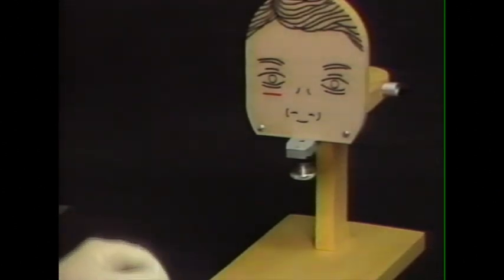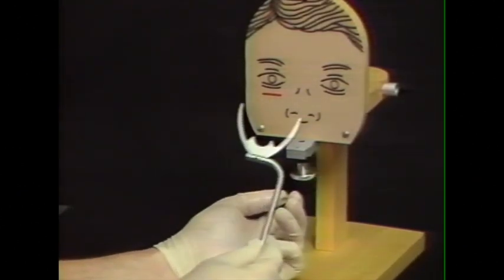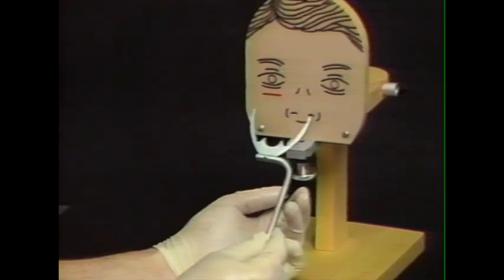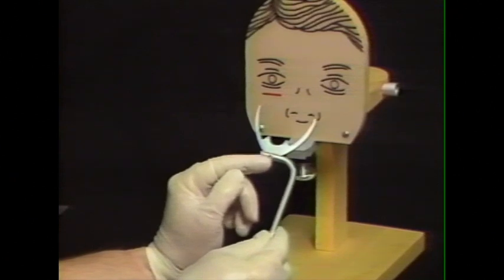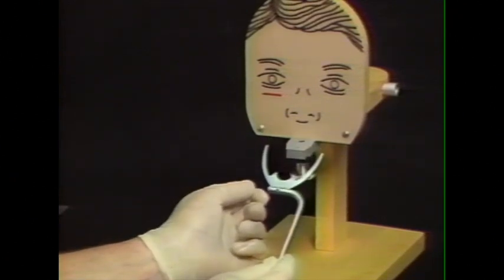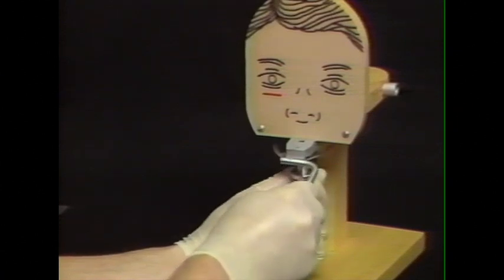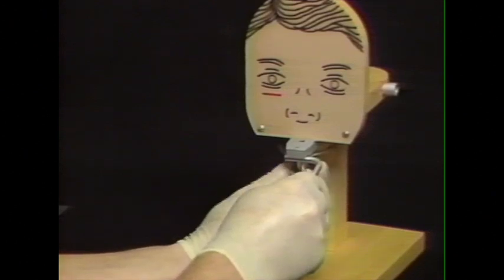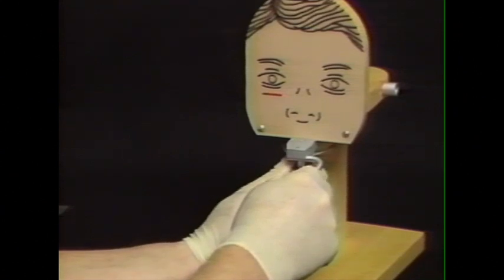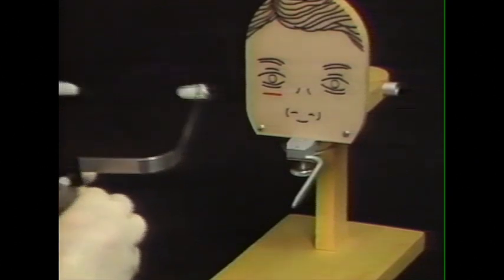Harvey has a maxilla here that consists of a clamp to which the face bow fork can be placed. The fork is always oriented with this brass rivet on the top here in the upward position. Place that into Harvey. This simulates the use of compound or wax as a registration medium to relate it to the maxillary teeth. And we're next ready to apply the face bow.